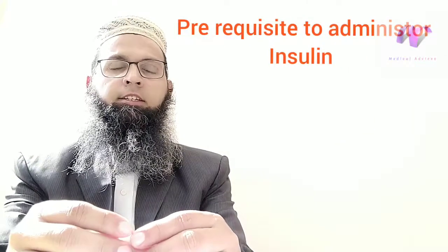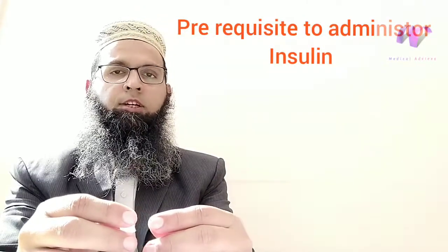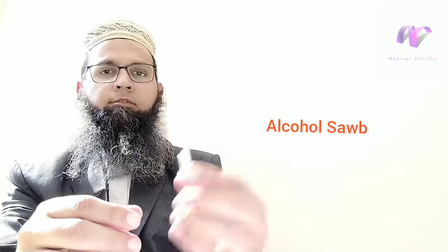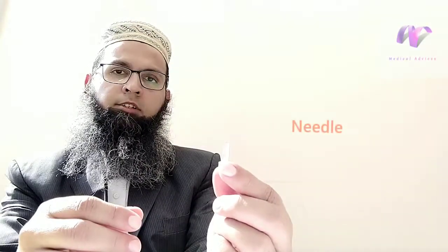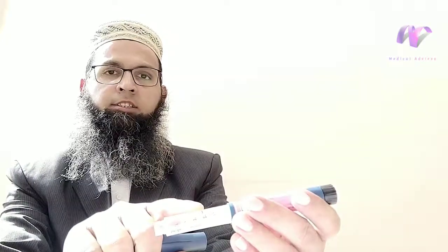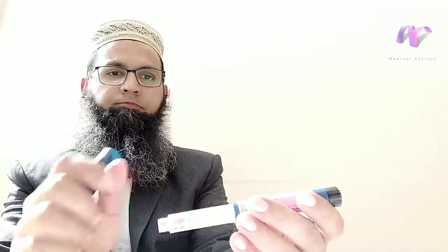Okay, when you are administering an insulin, you first need to make sure that you have all the required instruments that are needed to administer the insulin. The requirements are: you should have an alcohol swab, which you are going to use to clean the area. You should have a needle for the insulin pen, and you also have the insulin injection, and make sure that you have enough units to administer the required dose.